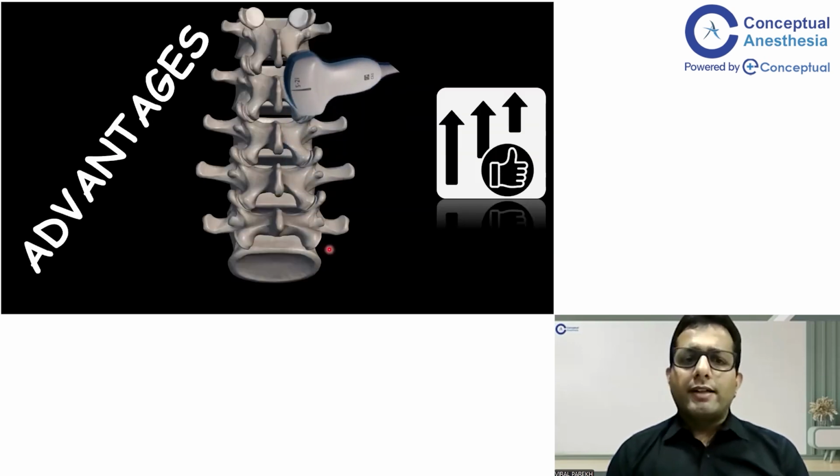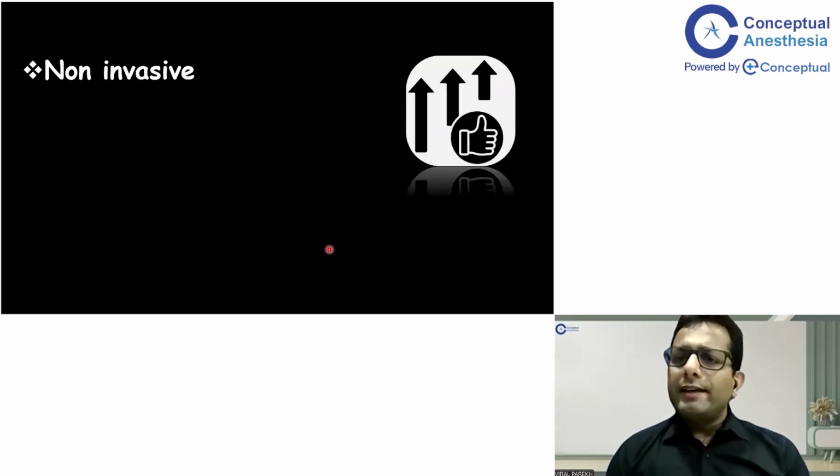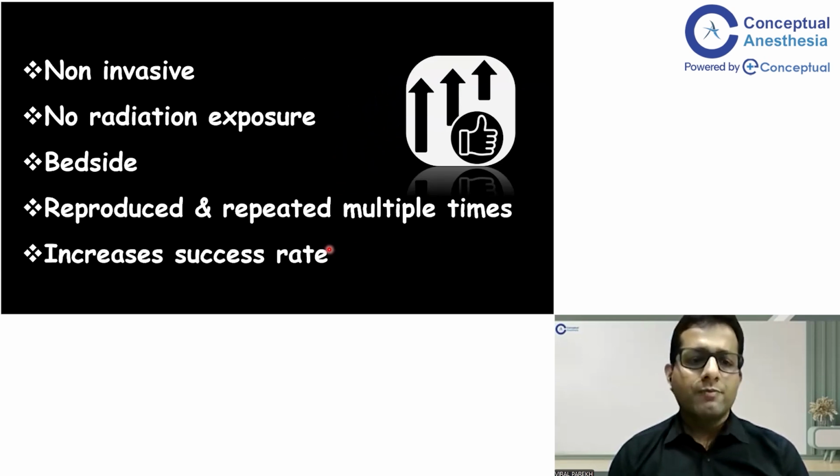Now let us come to the advantages of ultrasound in central neuraxial blocks. It's a completely non-invasive technique. There is no risk of radiation exposure. It's a bedside tool. It can be repeated, reproduced multiple times. So that is an added advantage. And definitely it increases the success rate.